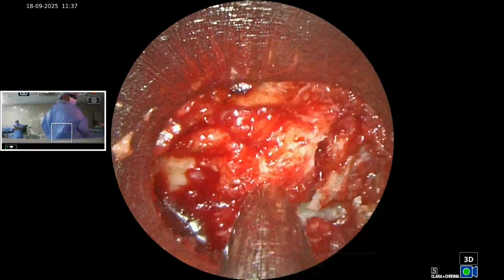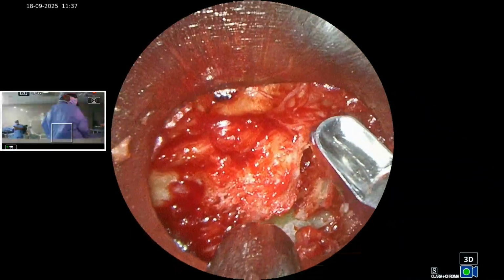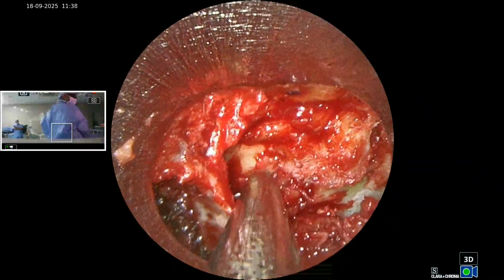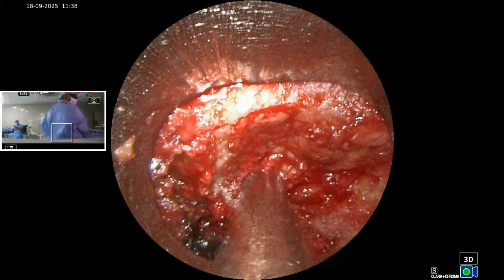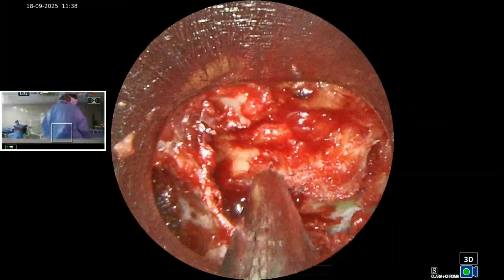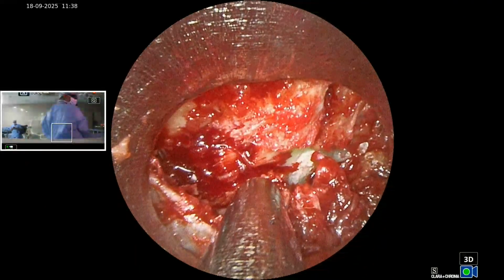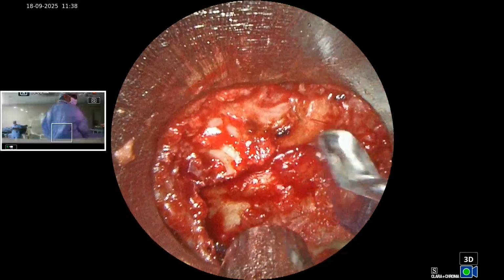The L4-L5 is the mostly affected, and this is the L4-L5. This is the spinous process, superior lamina, inferior lamina, facet. So cranial, L4 lamina, caudal, L5 lamina, facet, and the spinous process of midline.